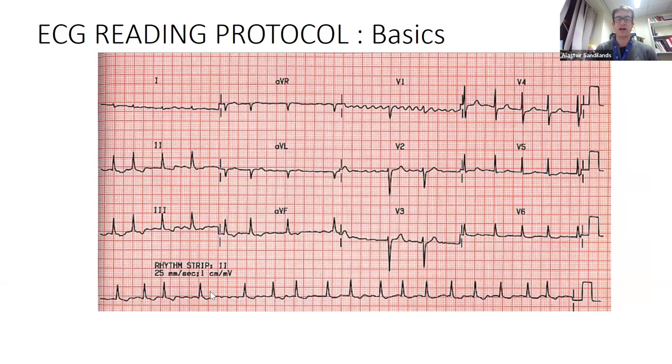One of the things to look at on the ECG, another way to say it's AF, is interesting. V1 is, where I'm pointing on my chest, here, to the right of the sternum, and the atria are high up in the chest. So this is what you see: the atrial fibrillation going along, then it conducts to the ventricle. Atrial fibrillation going along, conducts to the ventricle. Atrial fibrillation. So you can see between, that's the fibrillation occurring. That's one way of trying to check that it's atrial fibrillation.